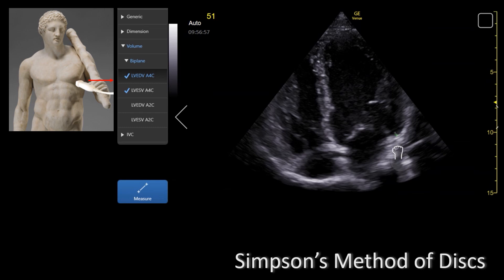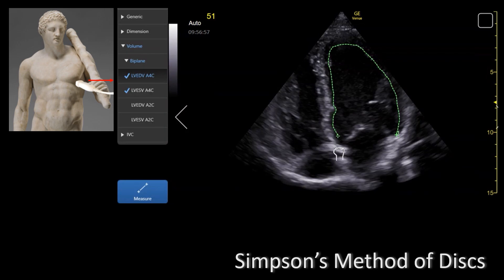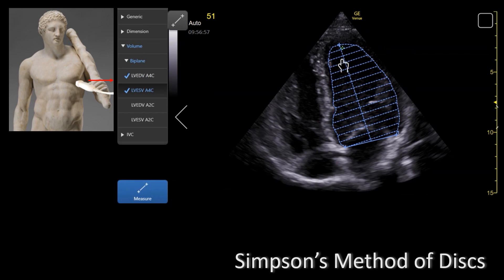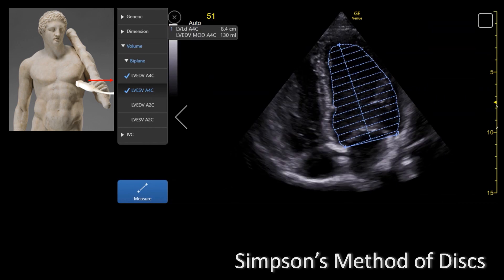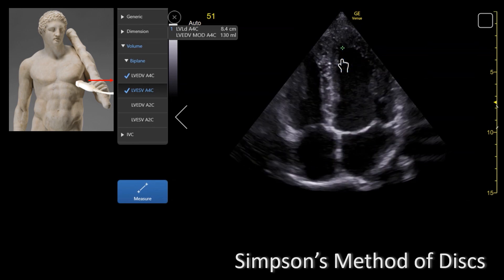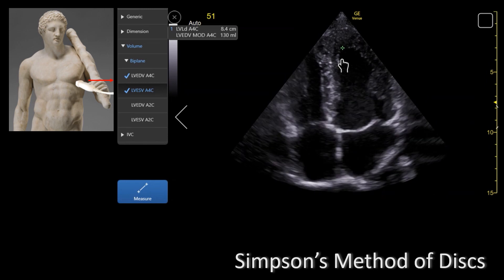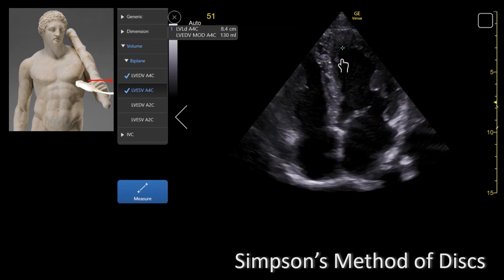You would need to start at the mitral valve ring and trace the left ventricle. When you reach the opposite end of the mitral ring, the machine will connect the two ends by a straight line. When measuring the LV volume, you are tracing the blood-tissue interface, so you want to be as close to the endocardium as possible. It is very important to note that you should not include the papillary muscles or the trabeculations in the endocardial tracing. The length of the LV is the distance from the middle of the line to the apex. As you can see now, the disks appear on the screen, and the LV volume is derived by addition of the volumes of all of the disks.